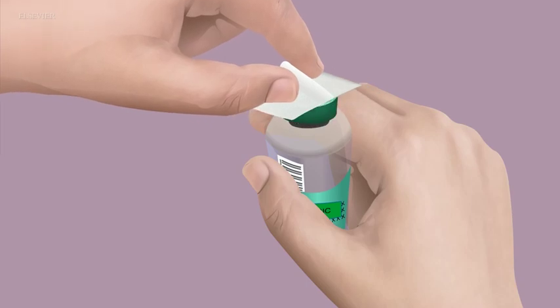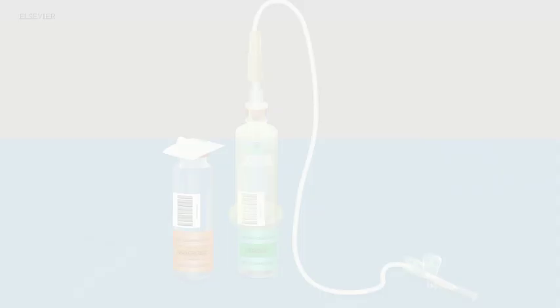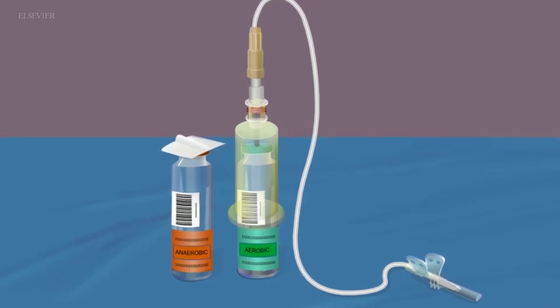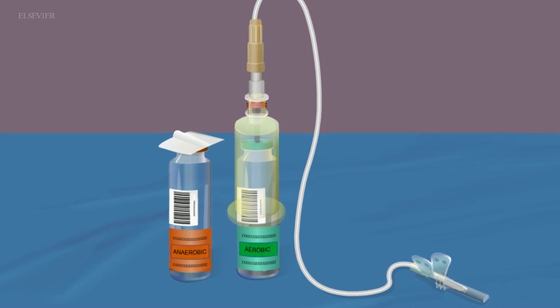Disinfect culture bottle tops with 70% isopropyl alcohol. If using a vacuum extraction system, position the culture bottle securely, upright, and close enough to the venipuncture site so that the tubing connected to the needle reaches from the selected vein to the upright bottle. Rest the collection barrel over the aerobic bottle. Wait to puncture the rubber stopper with the sheathed needle.